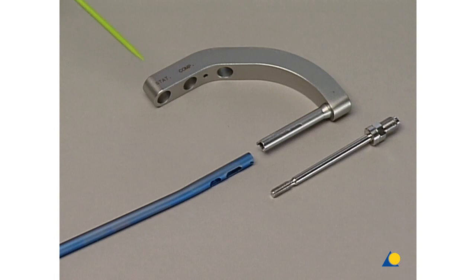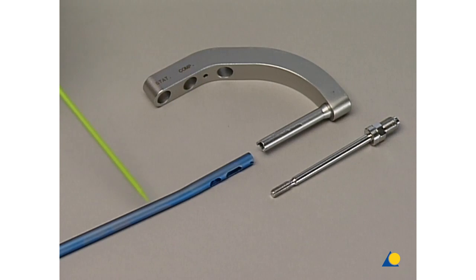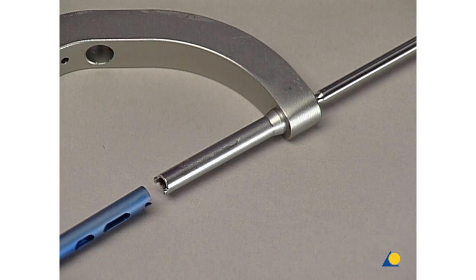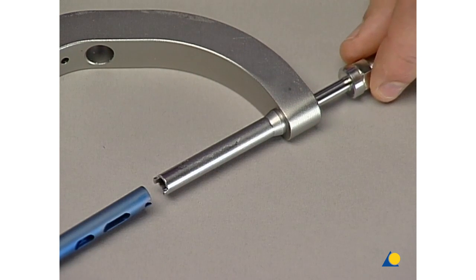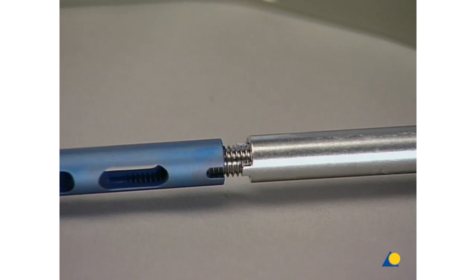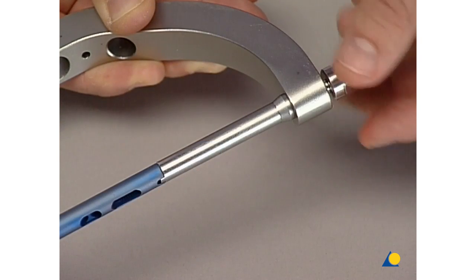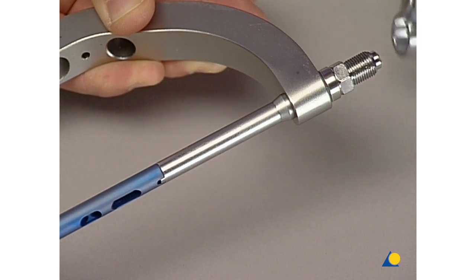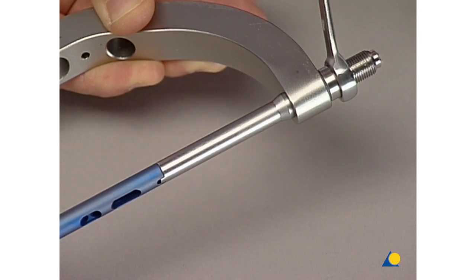We connect the insertion handle to the 7.5 mm UHN, the apex of the nail bend pointing away, with the connection screw. Be sure that the handle tongues engage the nail grooves. Thread the connecting screw into the nail and tighten with the 11 mm combination wrench.